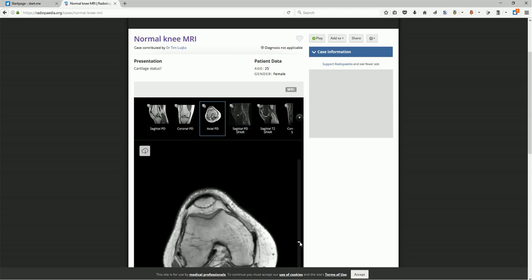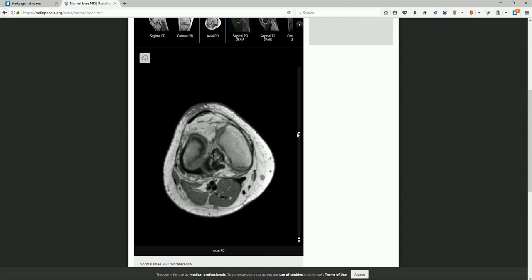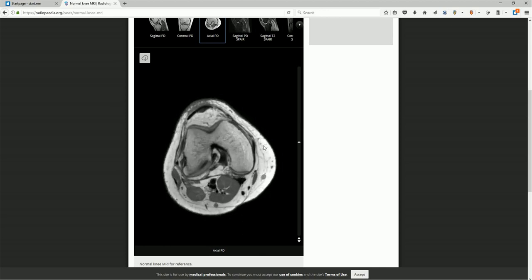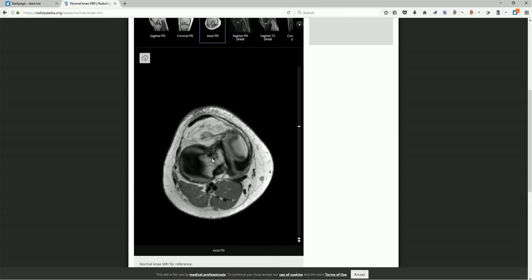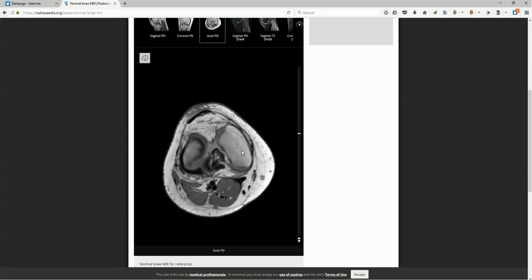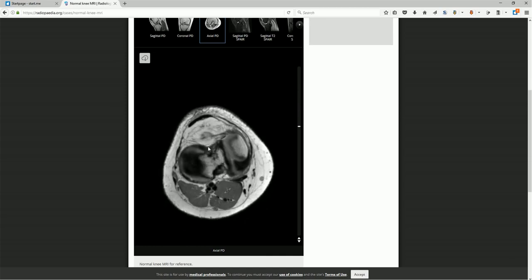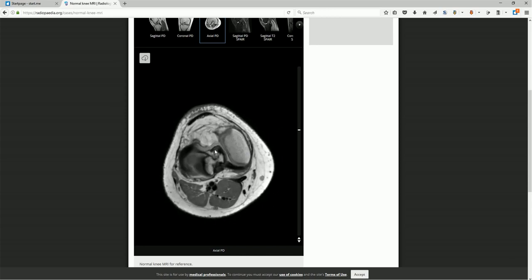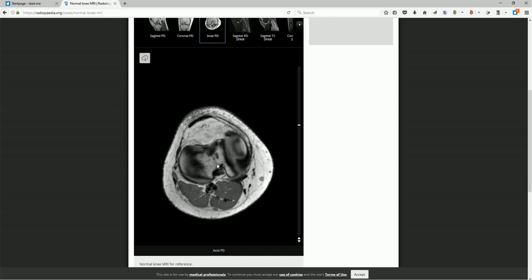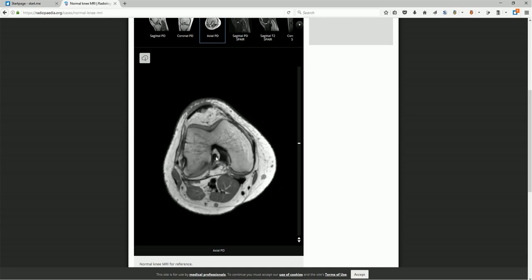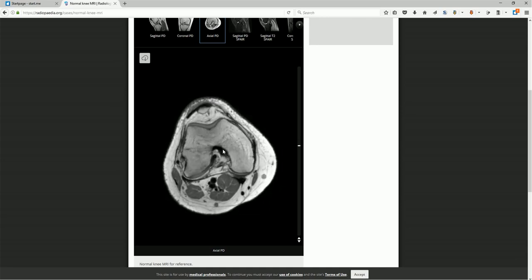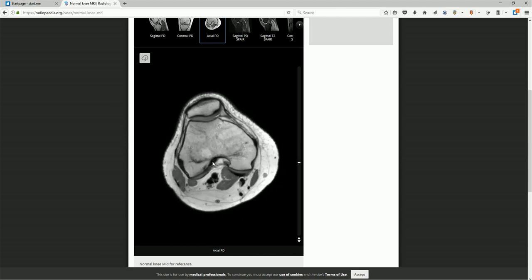Moving to an axial view: we've got the condyles of the femur on either side, moving down. We can start to see the tibias — this will be the tibial plateau. We should be able to see a little bit of the meniscus — there's the head of the fibula, so we're lateral, which means this is your lateral meniscus and this would be the medial meniscus over on the other side. You see a little bit of the ACL and PCL attached to the tibia. As we move back up, we can see how they crisscross because they're the cruciates — we can see the attachment of the PCL on the medial aspect and the ACL attaching into the lateral side.